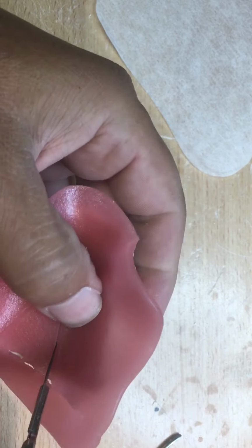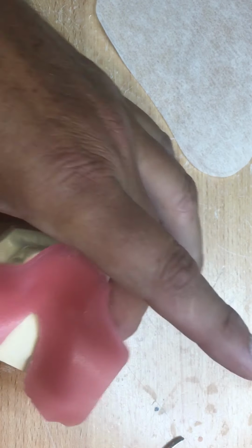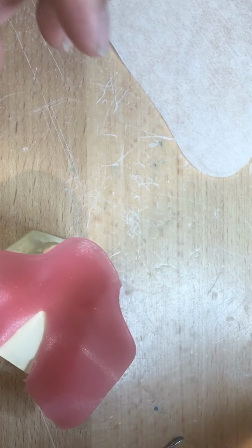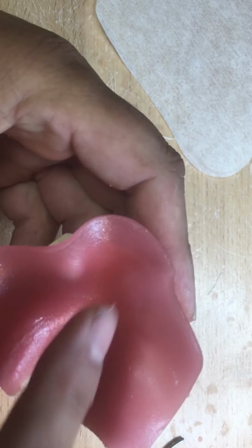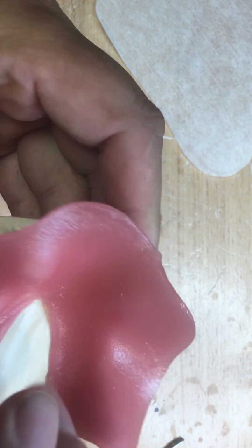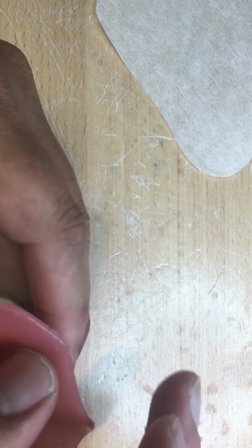Now, I'm not even near the extensions. I just want to eliminate this one so I can stretch it a little bit. Now, you can see this is kind of tacky. It would help if you put a little Vaseline on your fingers, and then it won't stick. I find this one I had out on the bench here was a little bit warm. So I'm going to use Vaseline on the top, just so my fingers don't stick to the light cure.